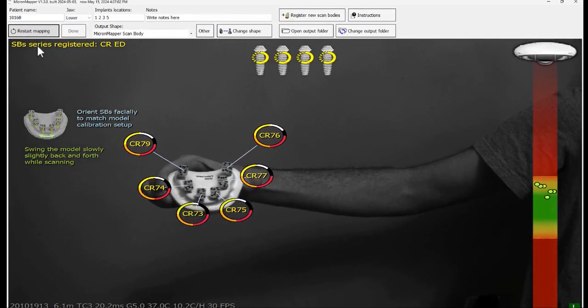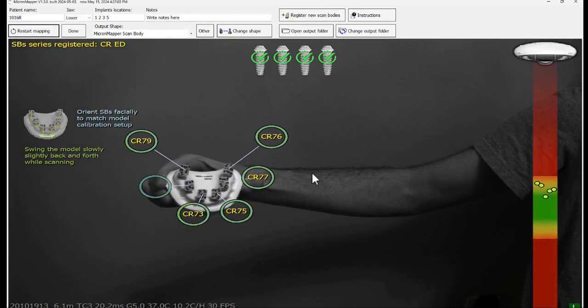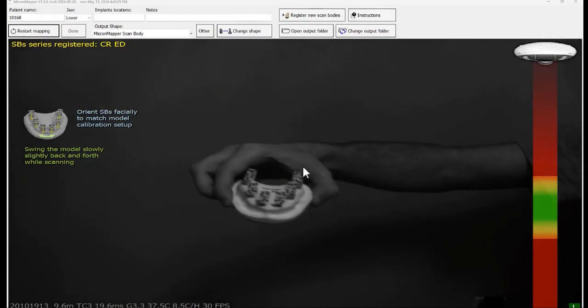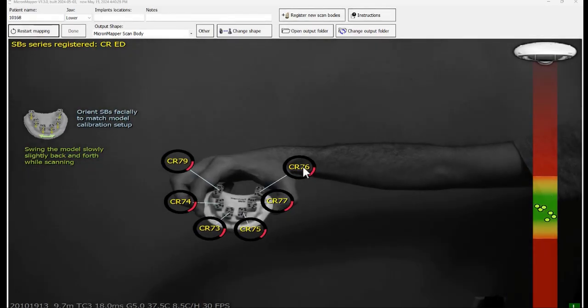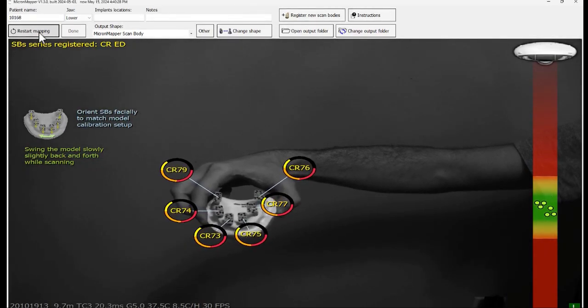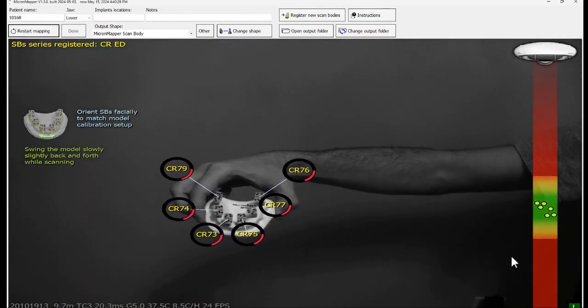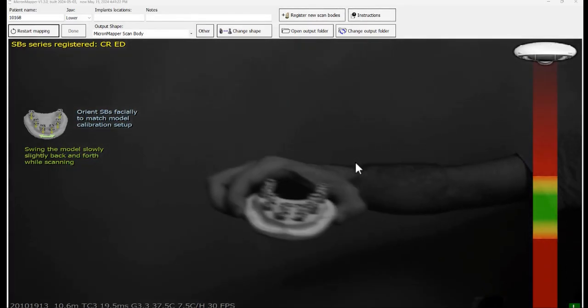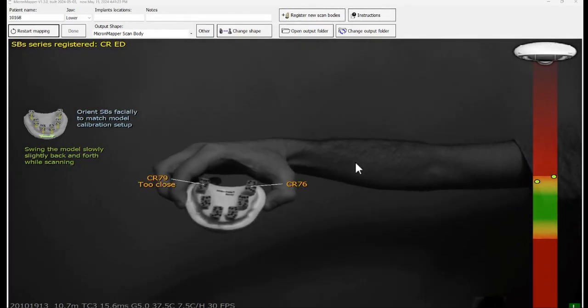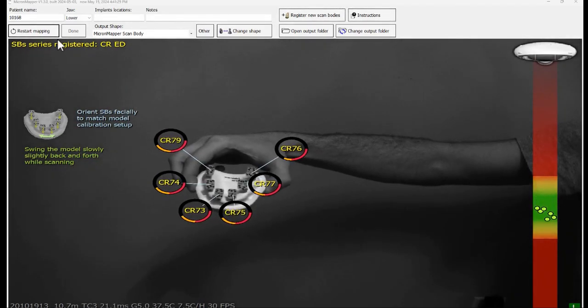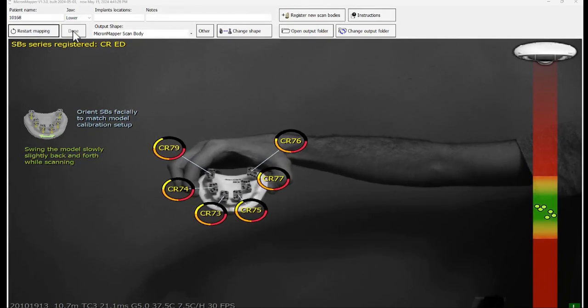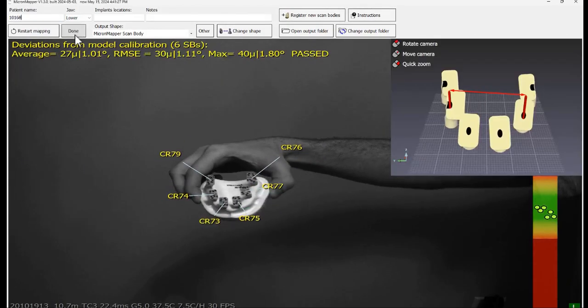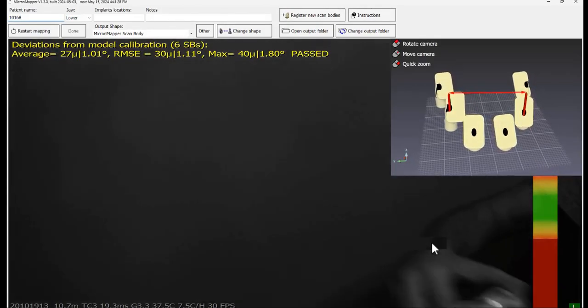If you are not sure of the result of the scan, you can click again on restart mapping and the process will start from the beginning. If you want to conclude the scanning before the target number of scan bodies is collected, you can click on the done button and the process will stop.